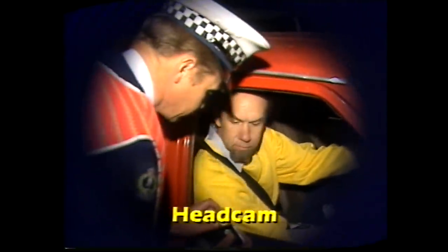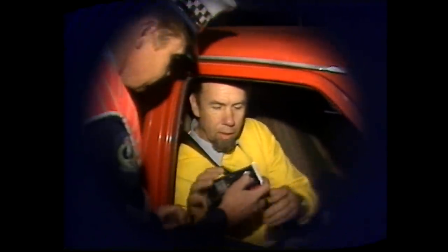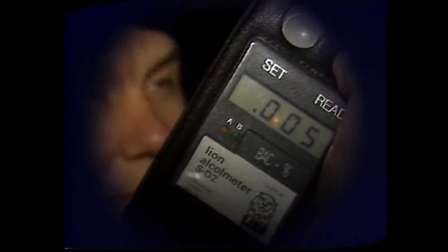Good evening. This is a breath testing station. I just want you to take one big deep breath and blow into this, and keep blowing until I tell you to stop. In this method of breath analysis, the driver is asked to blow through a portable electronic machine. Rob's alcohol reading of .005 is way below the legal limit.